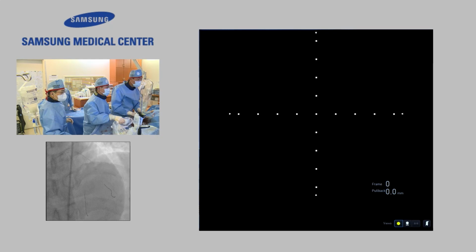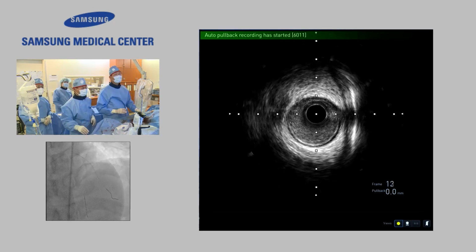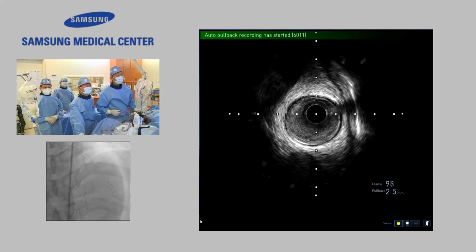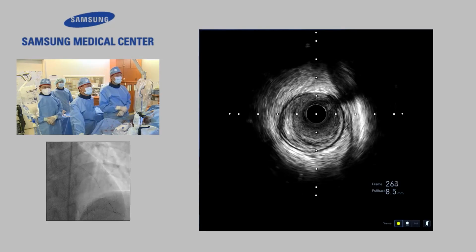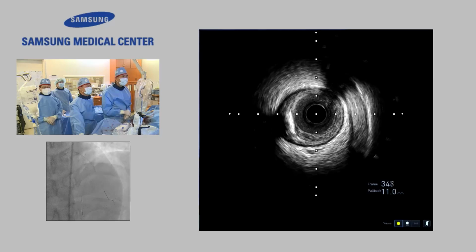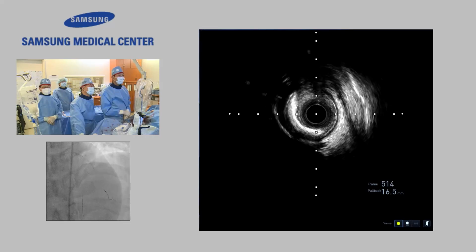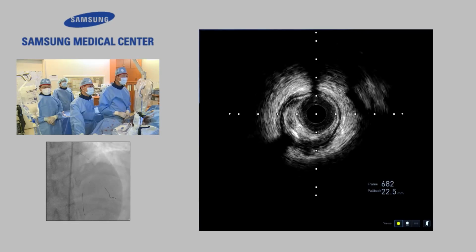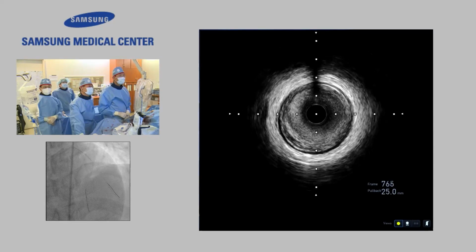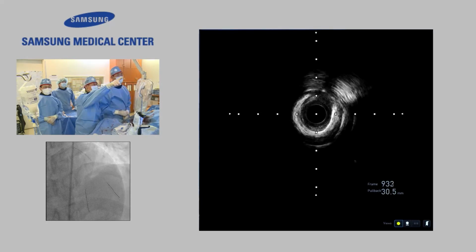Let's do the diagonal. IVUS. Just 2.0, yes, it's sustainable. It's getting larger than 3.0. There is some hematoma outside. There's some hematoma here. The first wire is going outside. It is 3.0, with some calcium in the middle. It's getting larger, even larger. That's a hematoma island.